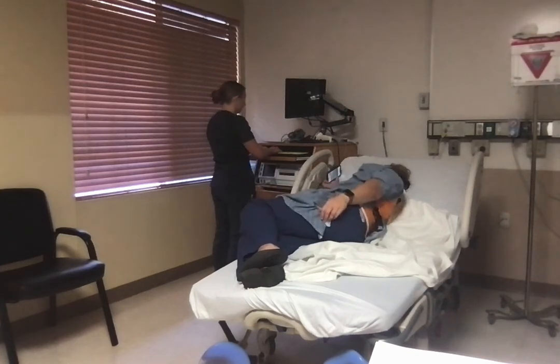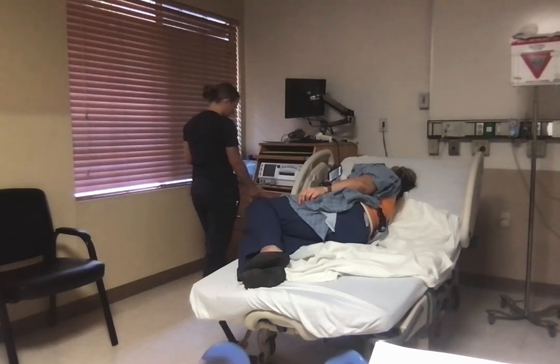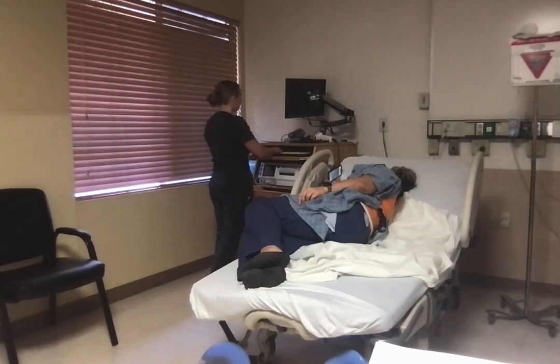Okay. After 20 minutes of observation, the nurse notices on the strip that the recurrent variable decelerations with moderate variability have now progressed into absent baseline variability plus recurrent variable decelerations. The category 2 fetal heart rate is now a category 3.